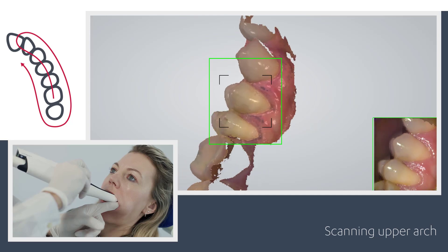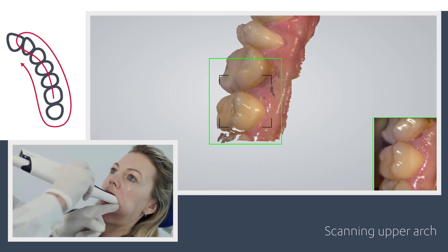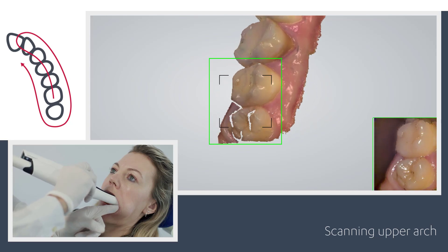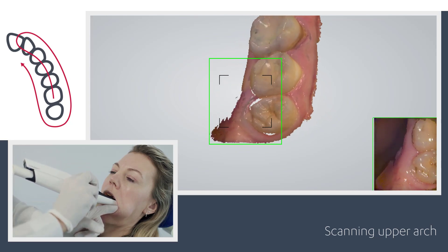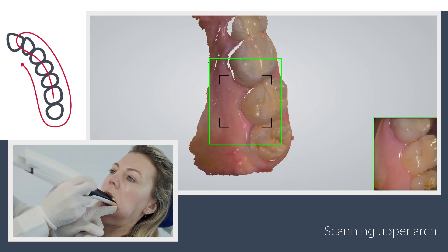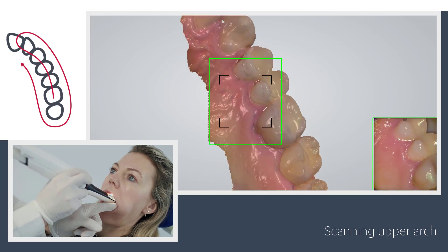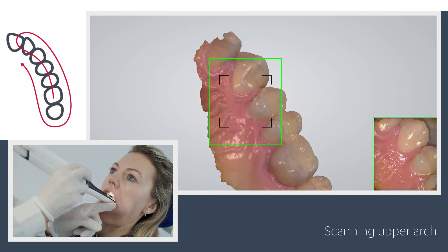Complete the buccal swipe until you reach the last molar. Then scan the palatal side, moving mesial, and stop scanning when the canine has been scanned.